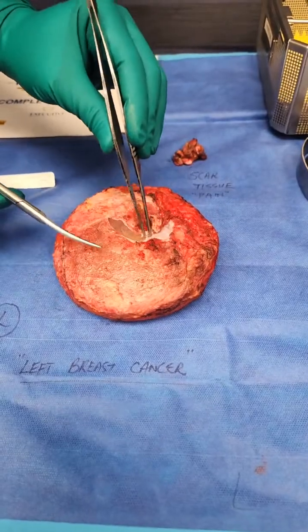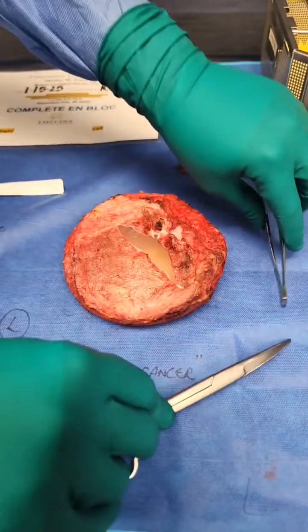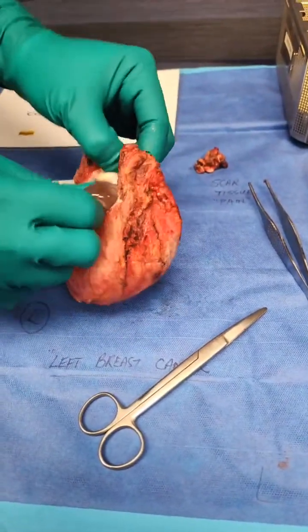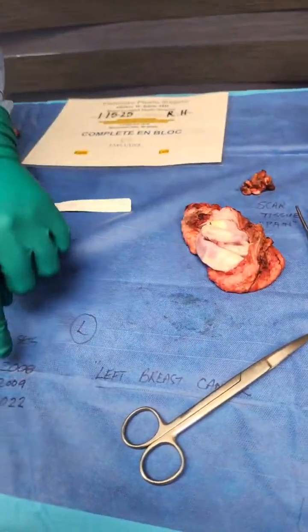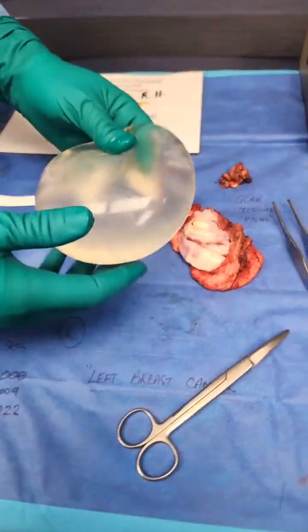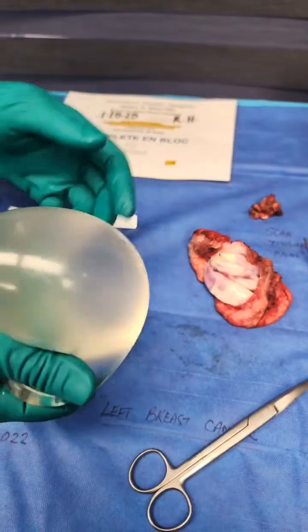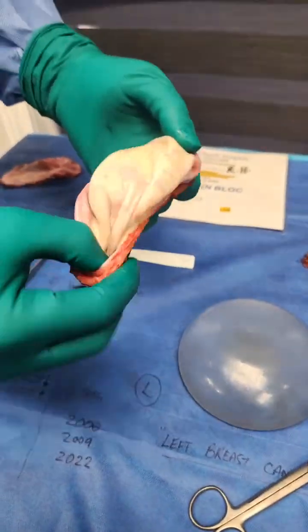This is a rectangular alloderm that's placed in the reconstruction. So I'm going to go ahead and remember this is the cancer side. This is the one I operated on second. And then as I remove, look at this intact implant from 2022 left breast cancer. And this is your 500 cc implant. And as you can see, it's in new condition. And what I'm going to do is I'm going to go in and invert this tissue.